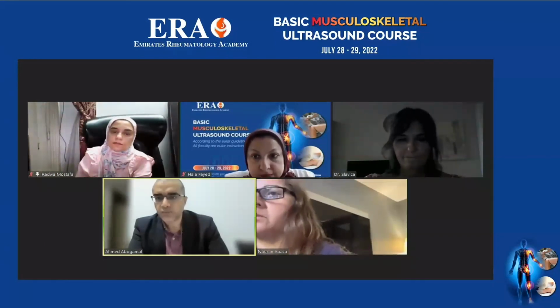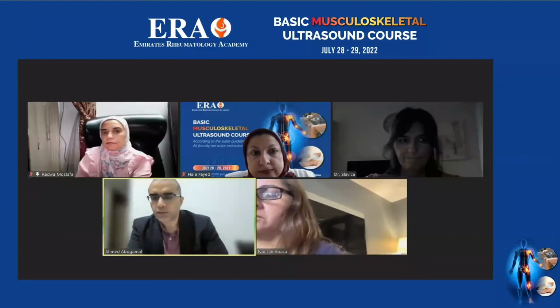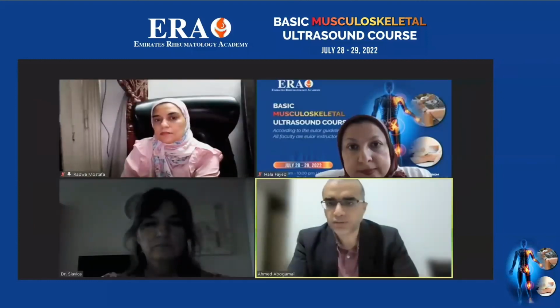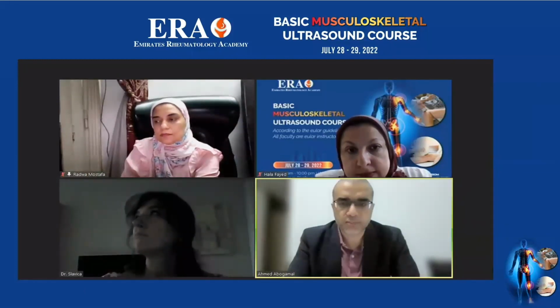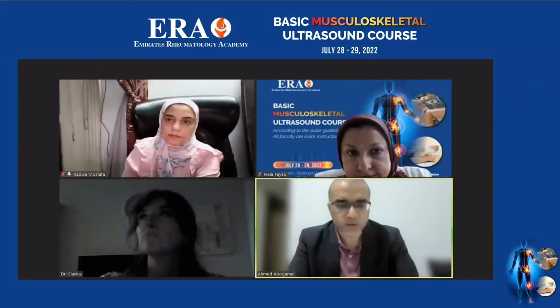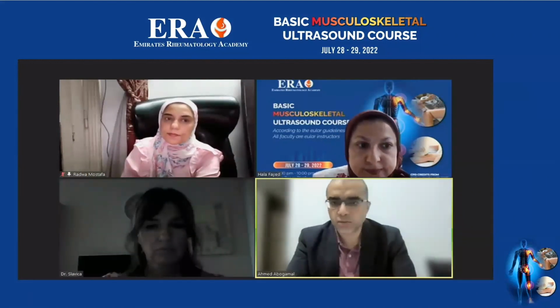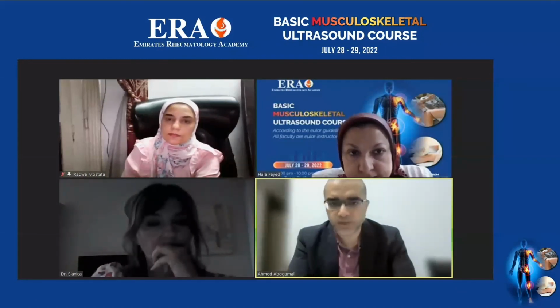Another question: can we depend on ultrasound for diagnosis of meniscus affection? Rita is not here with us, so I can answer this question about the meniscus. Yes, we can see the meniscal changes, especially crystal deposits, and can also differentiate between meniscal degeneration and tear, especially in the outer part. But to have a complete vision of all the lesions inside the meniscus, you have to rely on MRI. So MRI is superior to ultrasound for meniscal lesions in that indication.